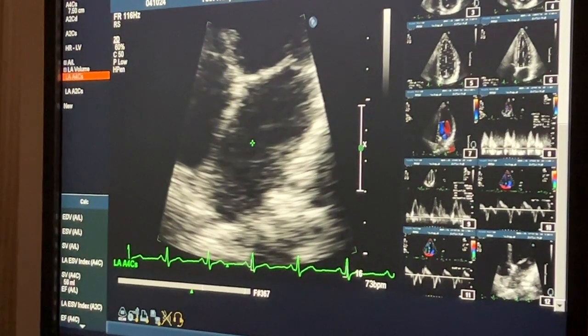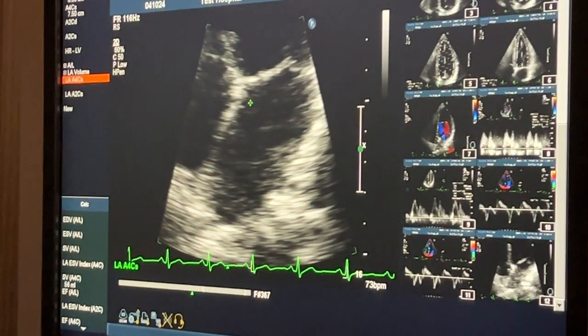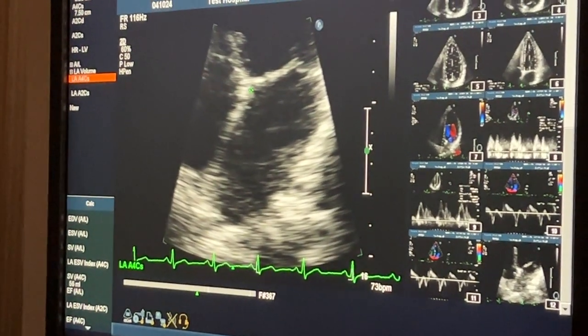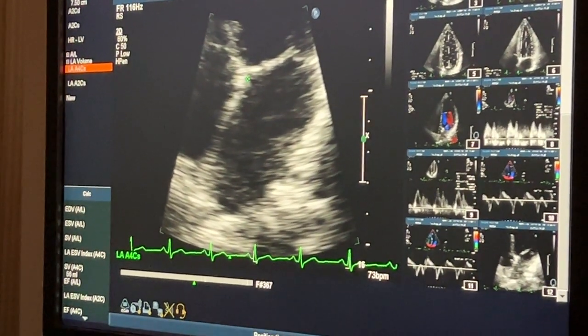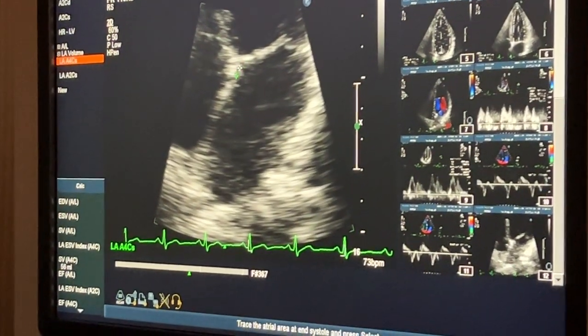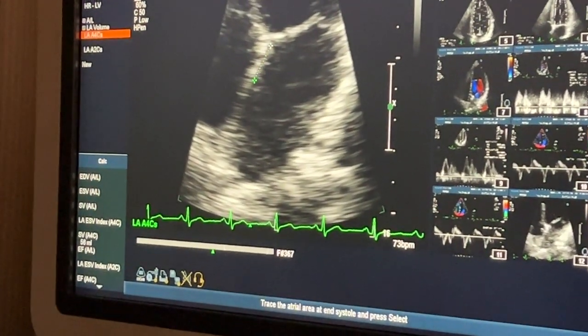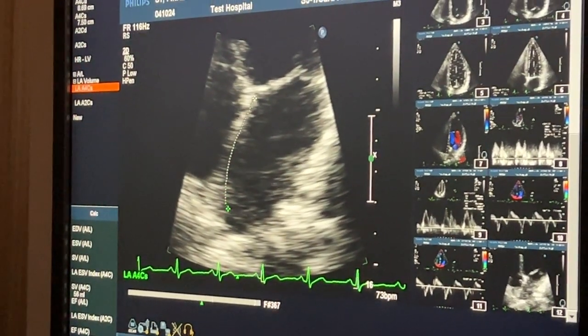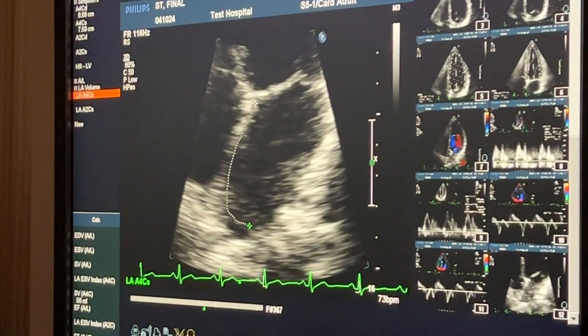A real echo? You just do systole. Would you ever do end diastole for any reason? I wouldn't say never, but I can't think of a good reason why you would do it. I challenge you in clinic, if you see an echo do that, we can talk about the applications of that. But yeah, I wouldn't really do that.